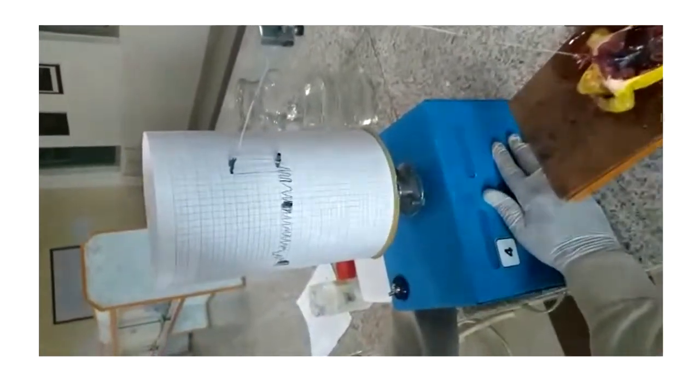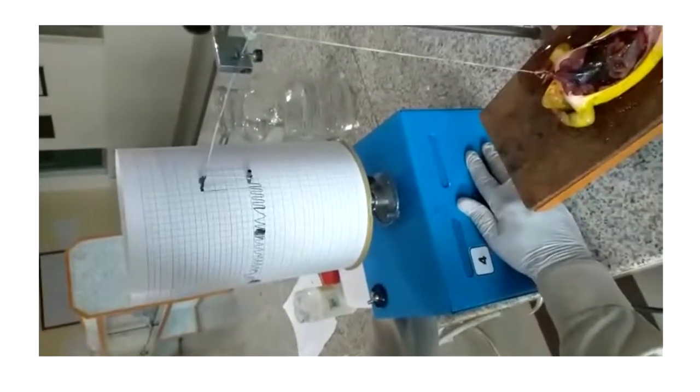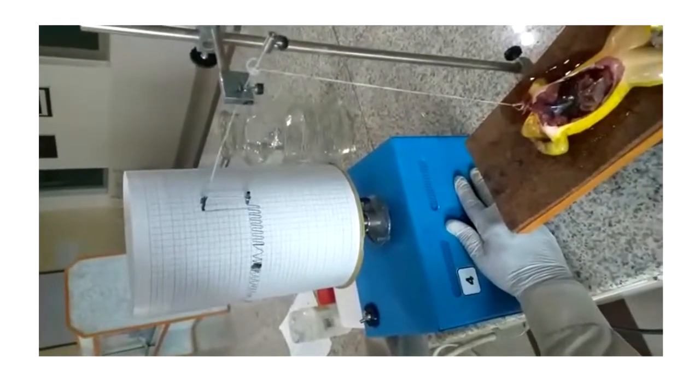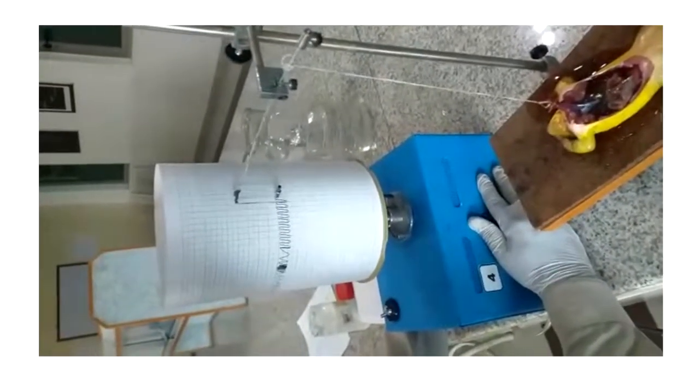You can see that the force of contraction and heart rate is increased. So this is the effect of stimulatory drug. Okay, stop.